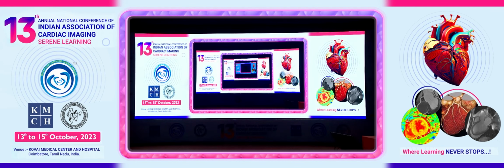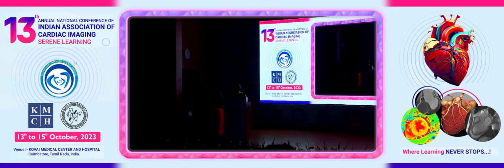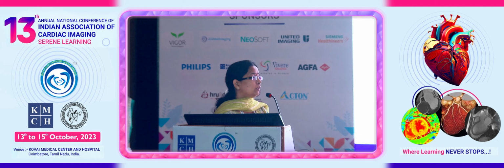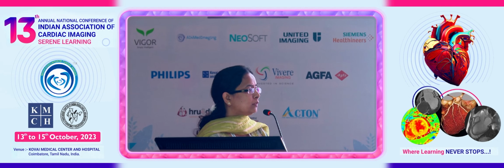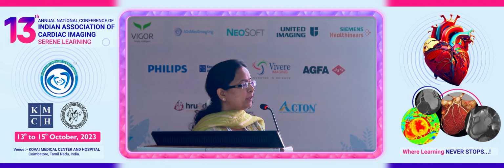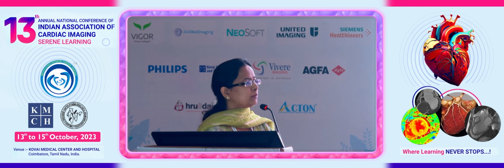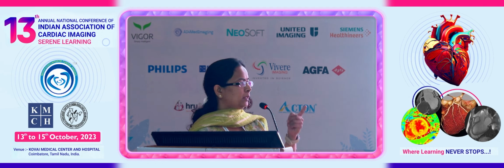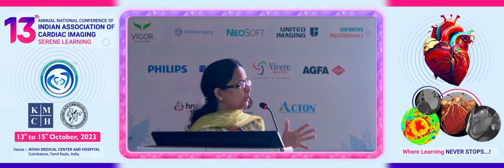Thanks for the interesting case. What was the thickness of the myocardium in the apical third on the end diastolic phase in this case? In what segment, sir? The thickness of the myocardium in the apical third. In the apical inferior, it was 1.6 centimeters. But the apical septum, anterior, and lateral wall were around 1.2.